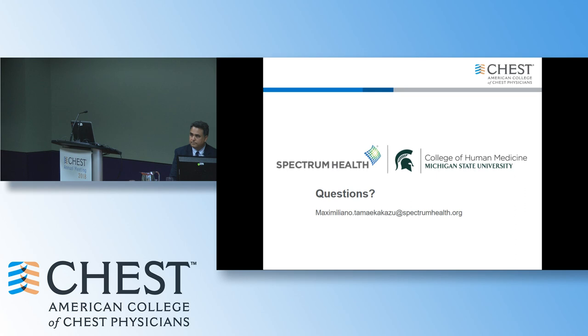Thanks for the presentation. I just wanted to know if we are using the transpulmonary pressure and in these patients increasing the PEEP to such a high level, and ARDS being a heterogeneous process, was there an increase in pneumothorax and barotrauma in one group or the other? The risk for pneumothorax is when you have a high transpulmonary pressure, that determines the stress of the lung. I don't recall any complication like pneumothorax in these studies reported.